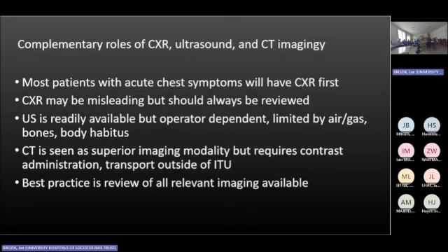I know it's exciting, but if you think what can happen, and sometimes things do happen, the best thing, I'm not sure if that happens before I retire, the best thing would be to have a scanner next to your unit. More time, and you won't have problems with the lift.